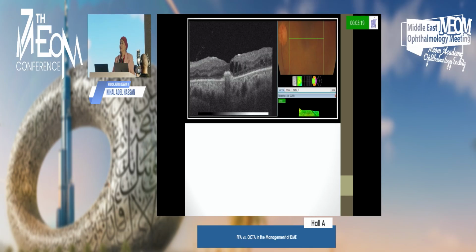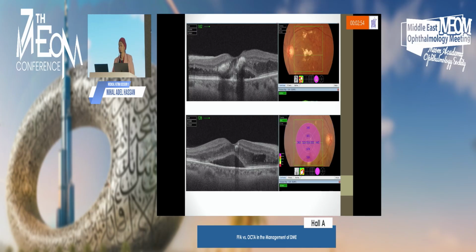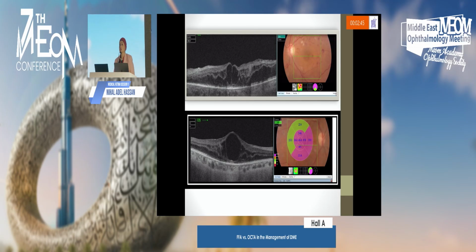that the OCT biomarkers are very important, which added a lot in the management and the conclusion of the macular part, starting from the cystic spaces and the calibration of the cystic spaces to put the degree of the prognostic visual factors, and the vitreoretinal interface, epiretinal membrane, vitreoretinal interactions, the subneurosensory edema with the exudation in the macular area, as well as the correlation with the choroidal vascularization, which is very important, of the perfusion of the vessels, the interrupted intraretinal septa carrying bad prognosis.